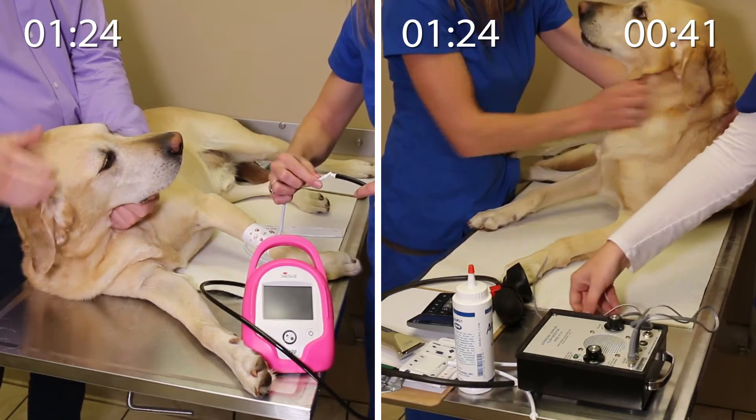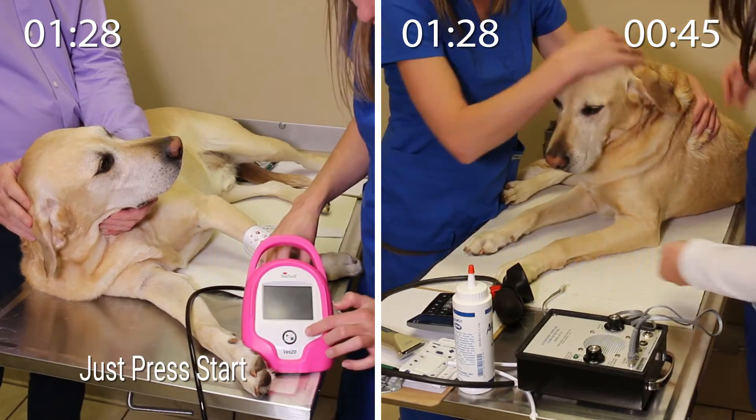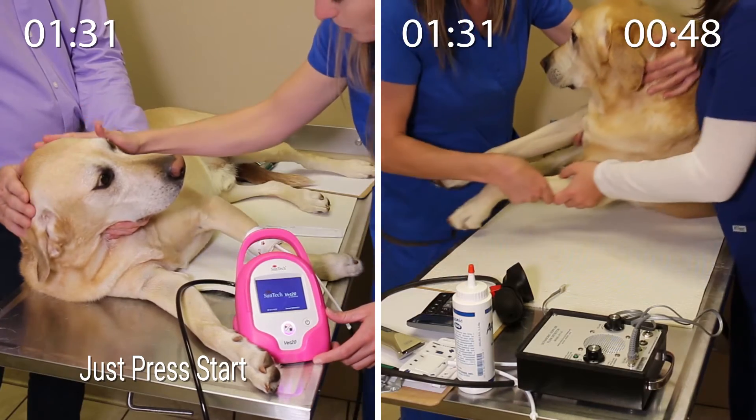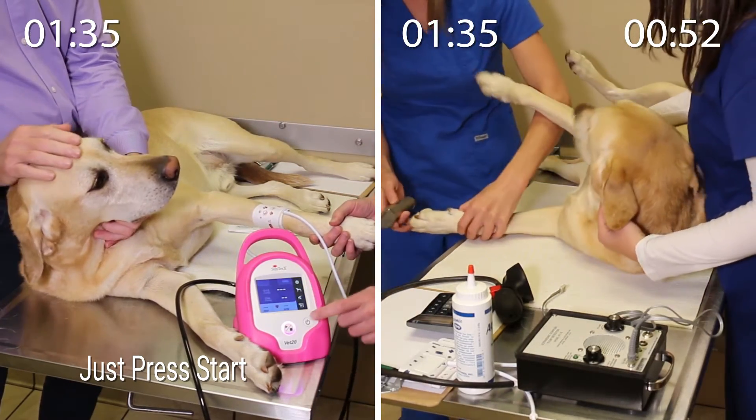Once the technician has connected the properly sized cuff to the patient hose, she simply powers on the device, selects Large Dog, and presses the Start button to start a reading, while making sure the cuff on Tucker's limb is at heart level.